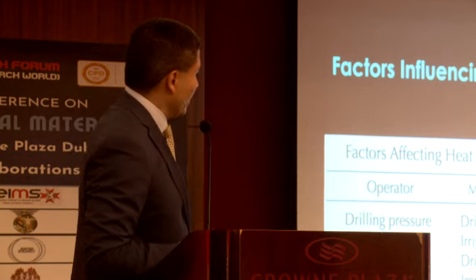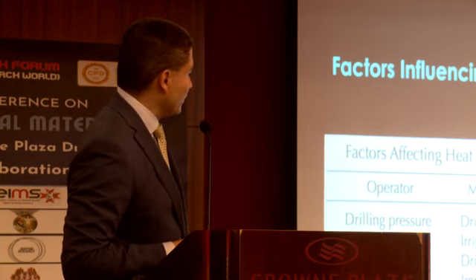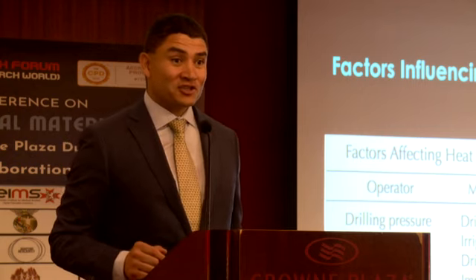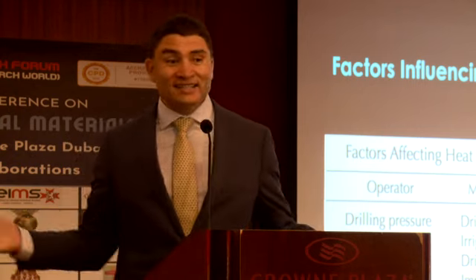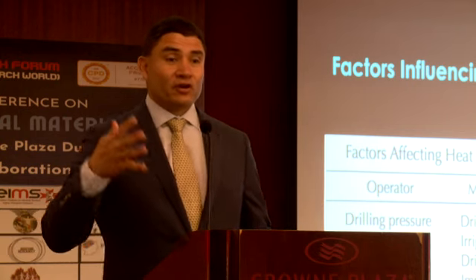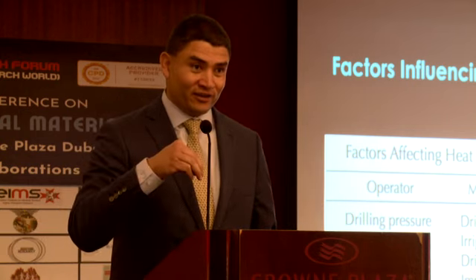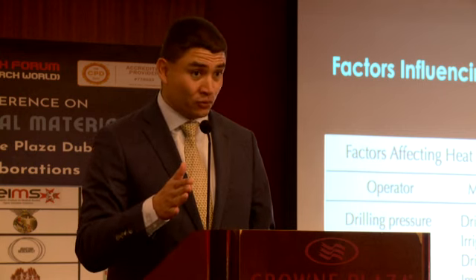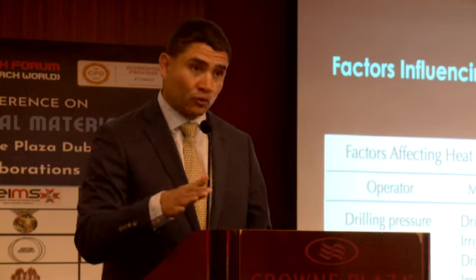Yeah. So, all right. From the manufacturer's perspective, the drill design, the irrigation system. It's fantastic. Why? Because the water cools down the drill. Does not happen, guys. Don't get fooled by that. Okay, I'm going to tell you why it doesn't happen in a moment.